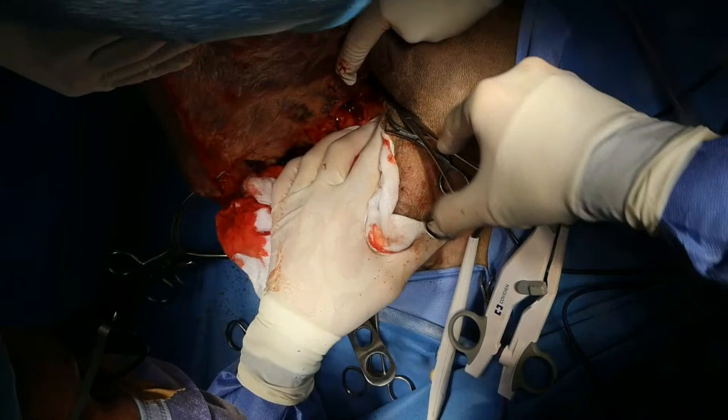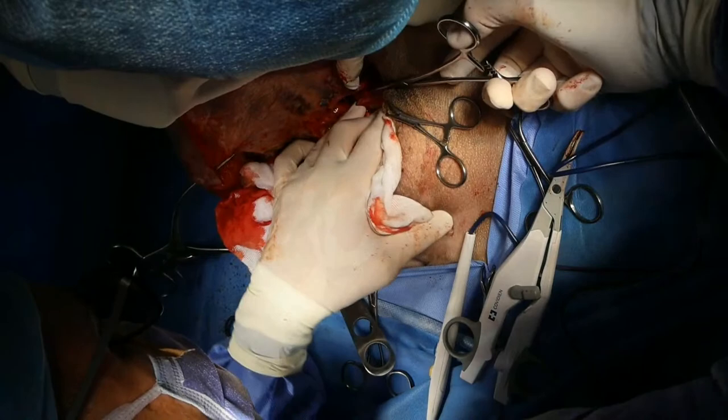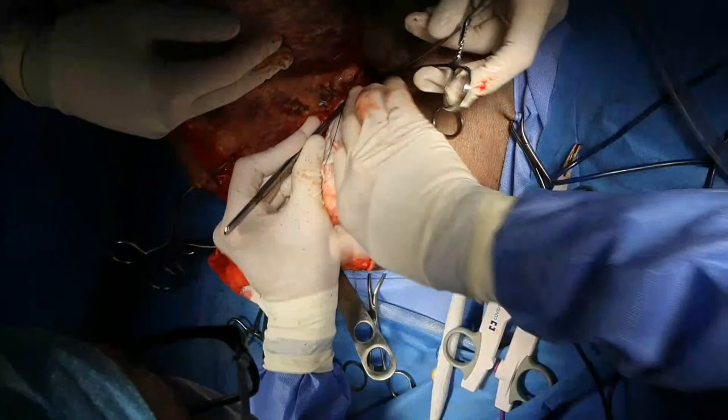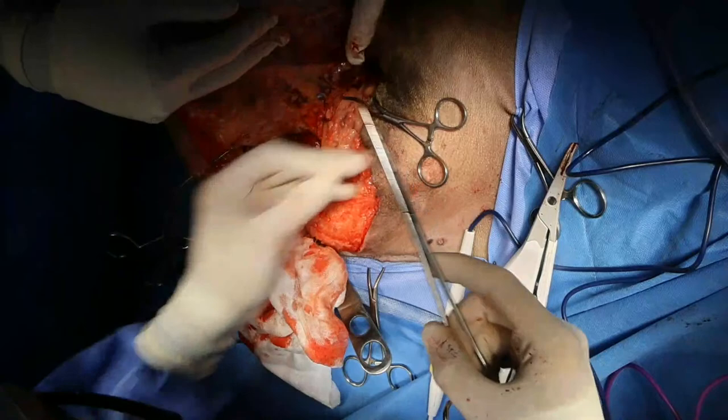So this iliolumbar vessel is the one that you can inadvertently cut when you're cutting that ilial wing. So if we can ligate that beforehand. So that's what I mean about taking your time and trying to ligate vessels before you cut them. So this is the iliolumbar vein that I'm ligating. You can see the abdominal fat creeping up into our incision here.